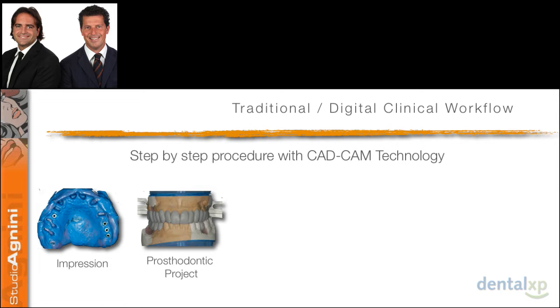And from here, where the CAD/CAM technology helped our technician was in the possibility of scanning this prosthodontic project and working on the computer with different software, in which the technician can work on the final framework design, can put his knowledge inside the digital technology, and design the frameworks exactly as he likes.